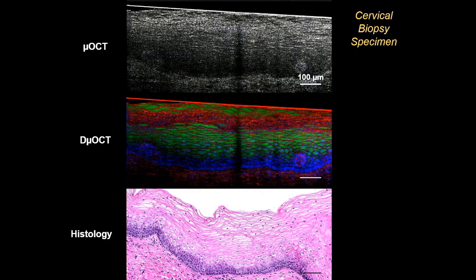And I can't tell you how important this is for the diagnosis of disease. In fact, it is probably the number one diagnostic criterion that we use as pathologists to assess the progression from low-grade dysplasia to high-grade dysplasia to cancer in all epithelia. And so it's amazing that we can actually see it.